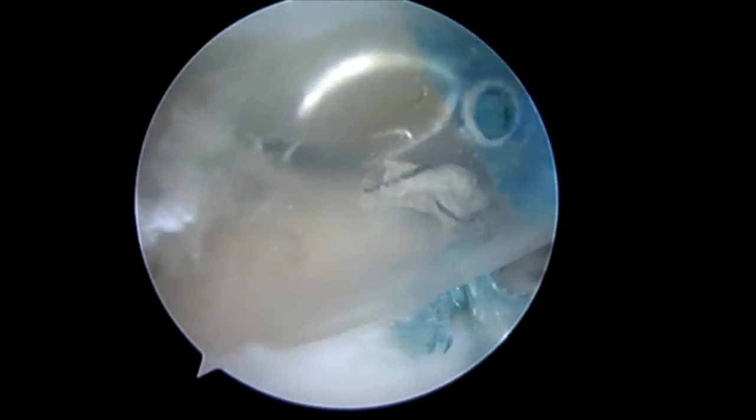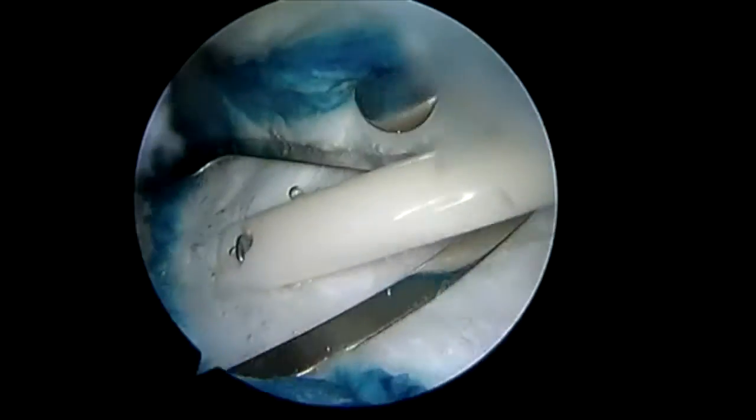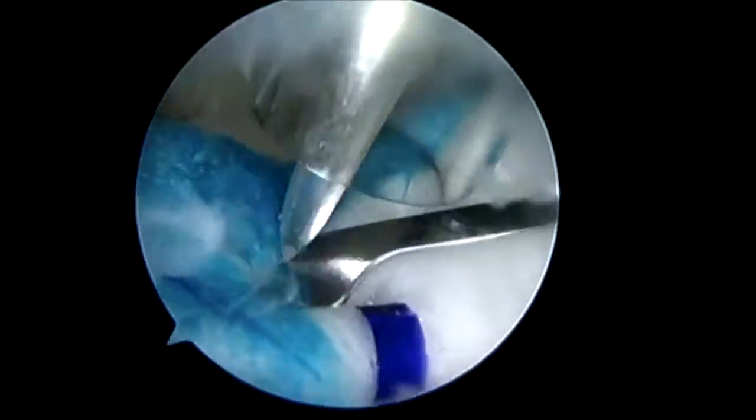Here is the delivery instrument. The rotation medical patch is contained within it. This will serve as our graft. This device deploys out and fans out over our supraspinous tendon. We can see our biceps tendon markers immediately helping us position.